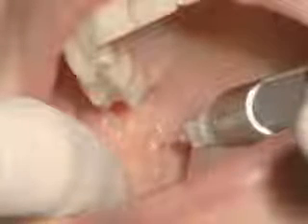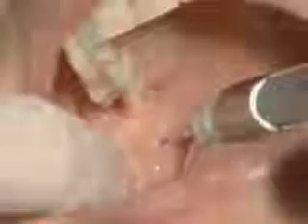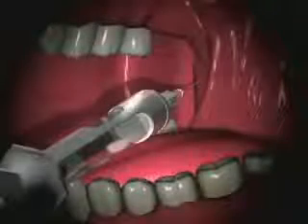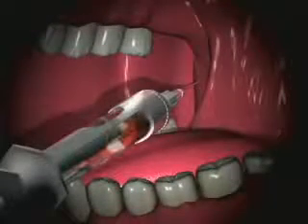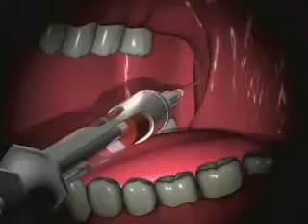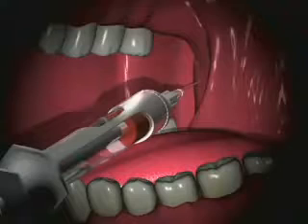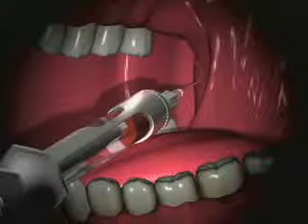Once bone is hit, you withdraw slightly, you aspirate, and slowly begin to inject a full cartridge of local anesthetic, unless you are following with a buccal nerve block, in which case you should inject three-quarters of the cartridge.